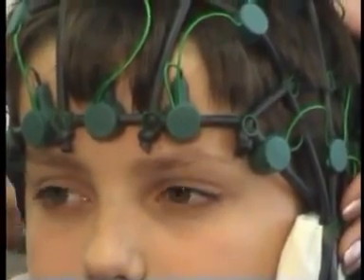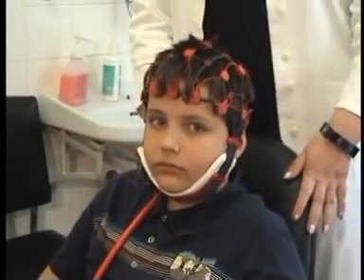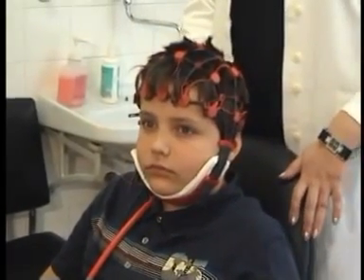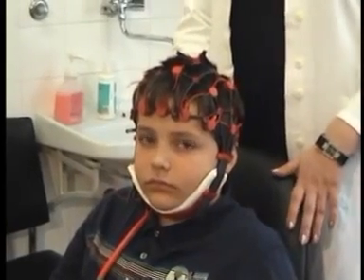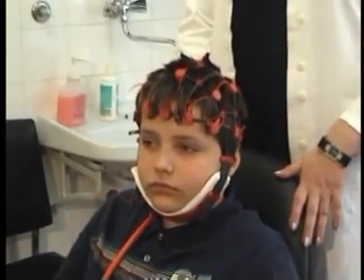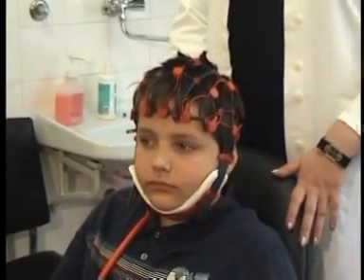The physician may interpret the results as a perfect image of brain activity. However, the physician does not know whether the aforementioned rules of electrode placement have been satisfied. This is up to the good education and the integrity of the EEG technician.